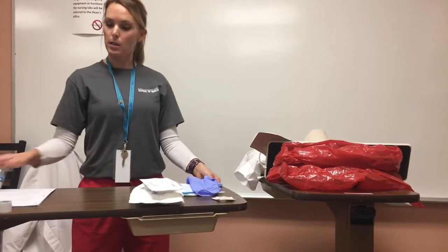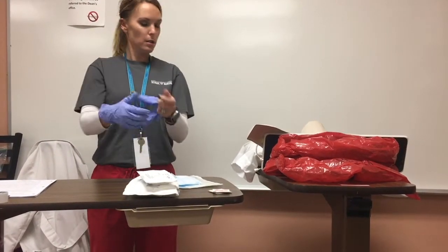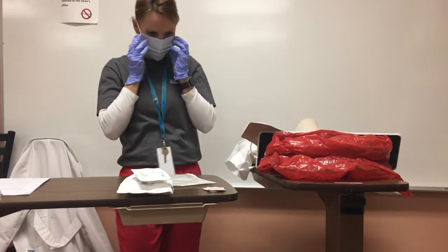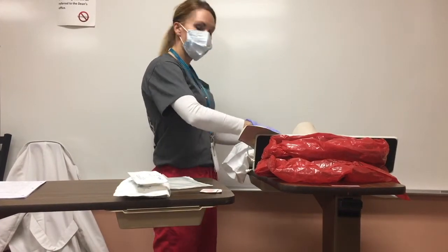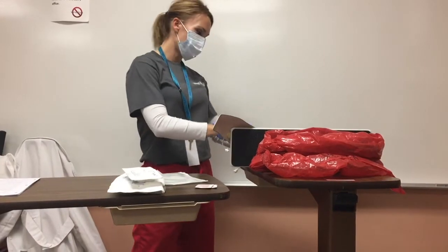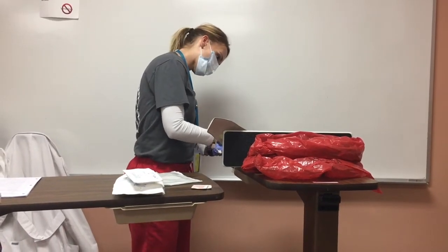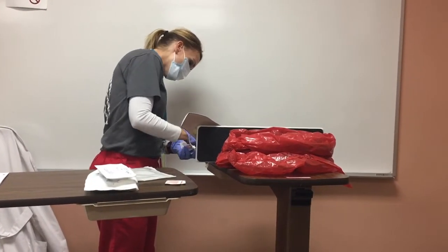So over here my site is all clean — I'm going to put on my gloves to remove the old dressing. I'm going to use my alcohol pad to remove the dressing. I'm ready to lay my patient flat. I'm looking at my patient — he is resting comfortably, denies complaints of pain, no shortness of breath. I'm looking at my site and the dressing is intact.